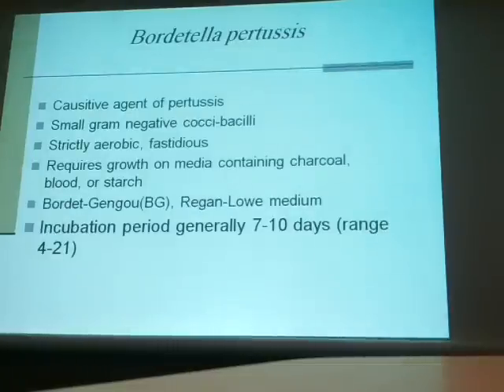Okay, this is the upper respiratory tract infection. Now the lower respiratory tract infection. For the upper respiratory tract, the representative sample was a throat swab. For the lower, of course, we will have the sputum.